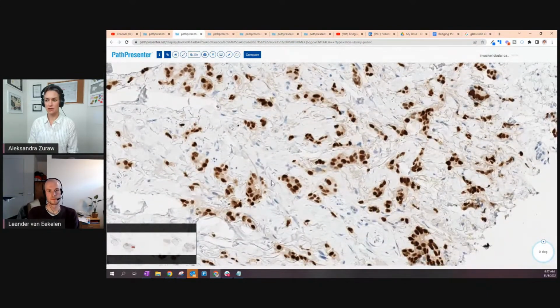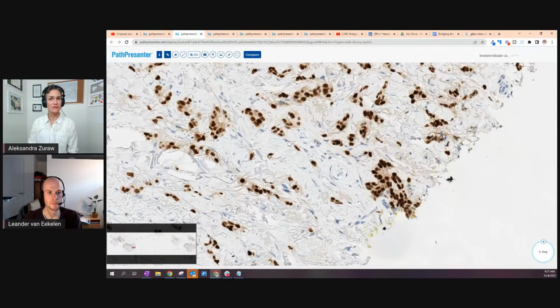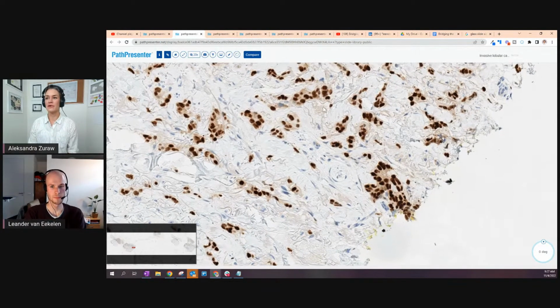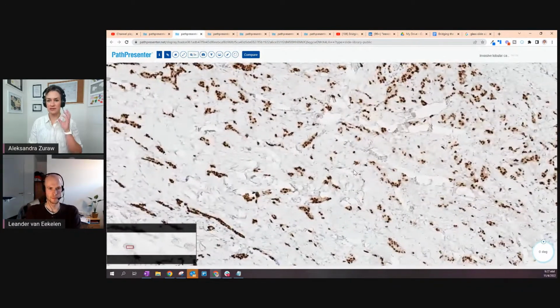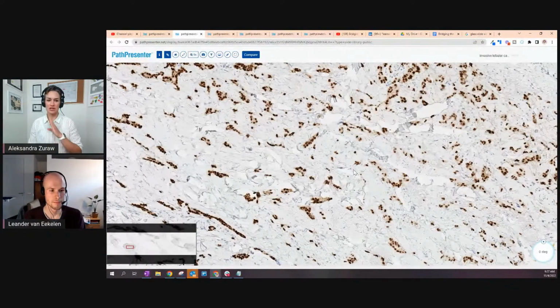You need object detection. You could maybe use instance segmentation if you're fancy and the cost and model training is not a problem for you. Yeah, exactly. When you have overlapping things, instance segmentation is a little bit better with that. So this is basically all object detection. If you use instance segmentation, except for the cost of training and processing, that would be a more granular counterpart, right? Yeah, sure.